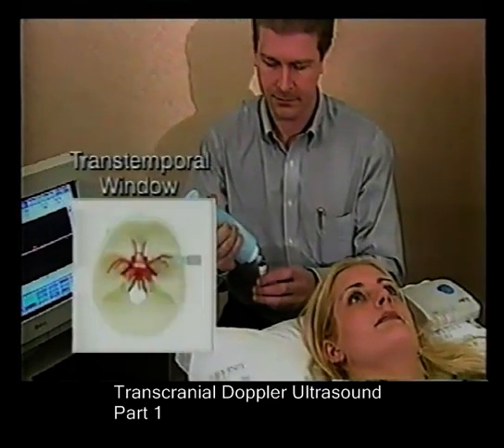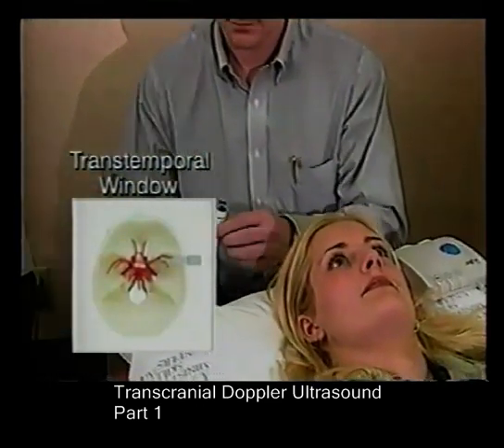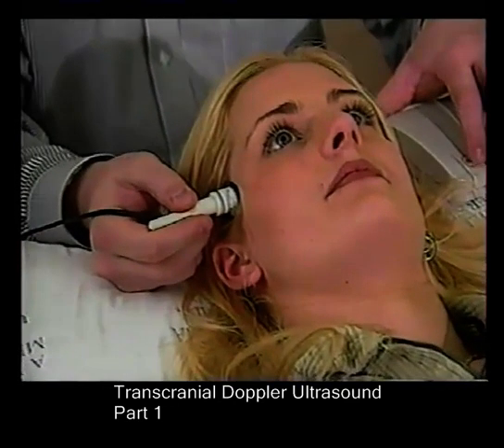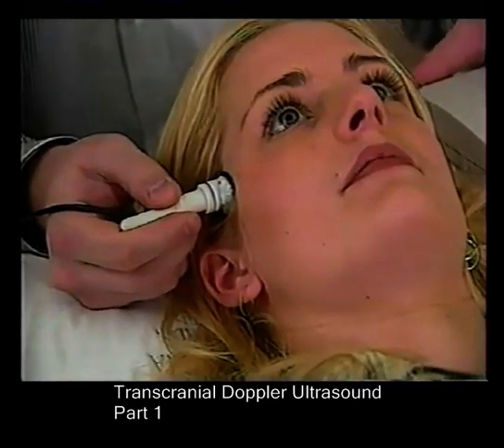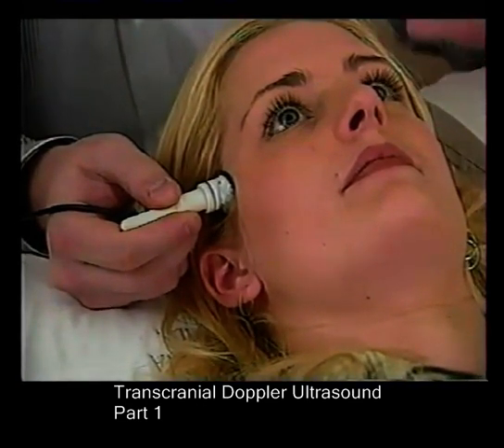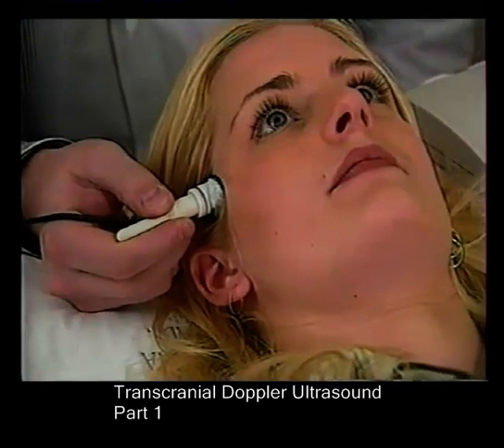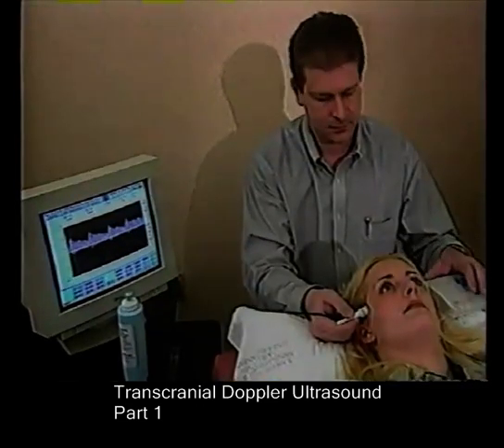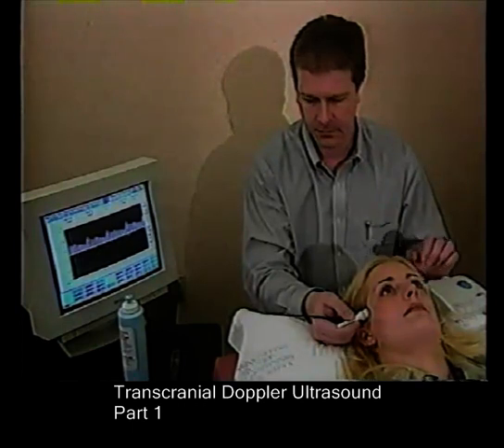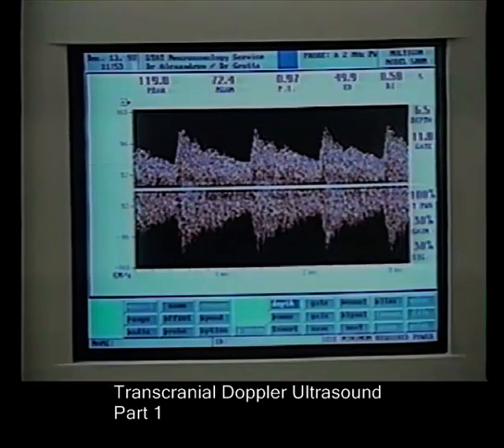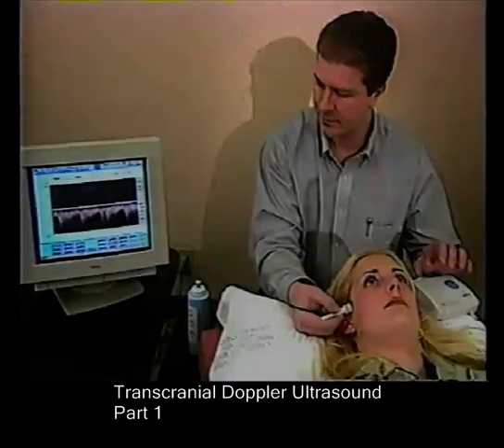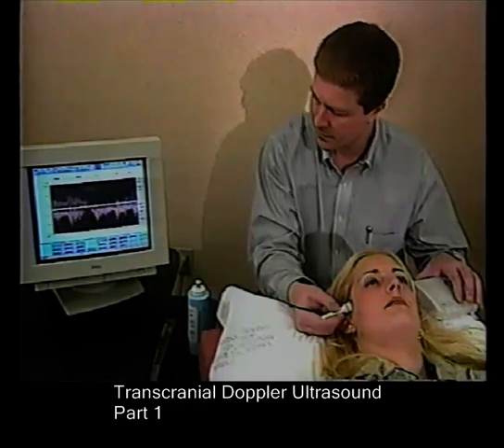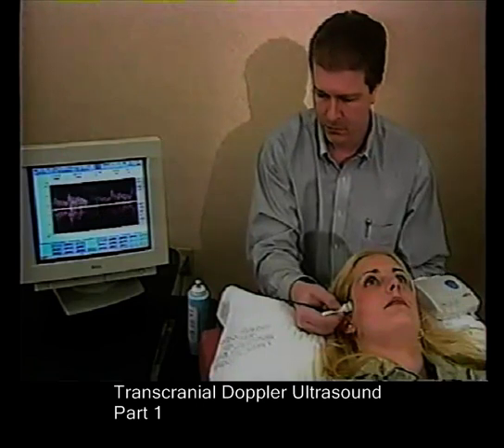The examination begins with insonation through the temporal windows. Insonation of the artery is made possible by a thinning of the skull in the area above the zygomatic arch. The examination starts at a depth of 5.0 centimeters, and the transducer is aimed anteriorly to evaluate the M1 segment of the middle cerebral artery. It is often also possible to sample the terminal internal carotid artery by angling the probe inferiorly. By increasing the depth of insonation, the bifurcation of the internal carotid artery is displayed, and further depth allows insonation of the A1 segment of the anterior cerebral artery. The communicating arteries are not generally evaluated except in cases of collateral flow.